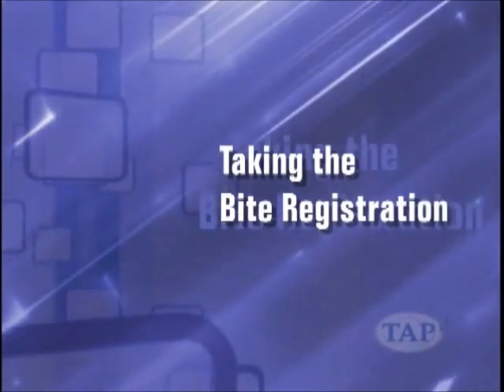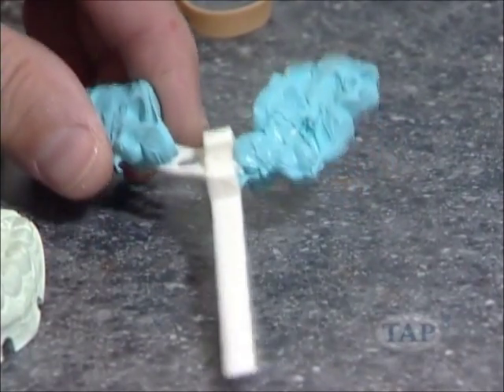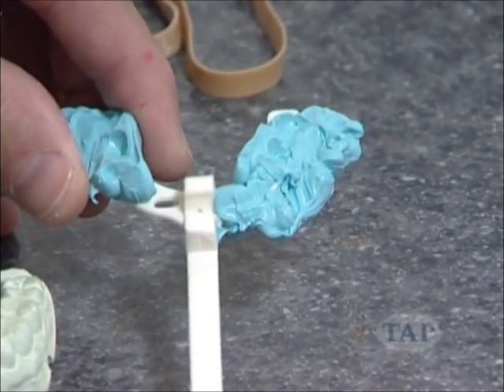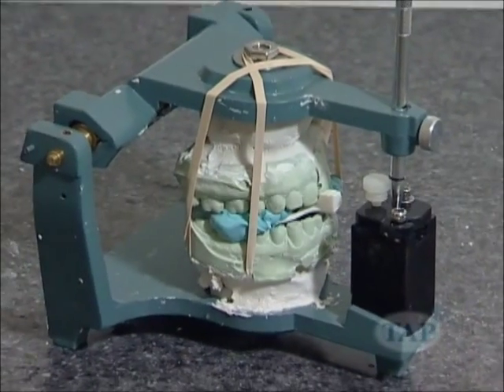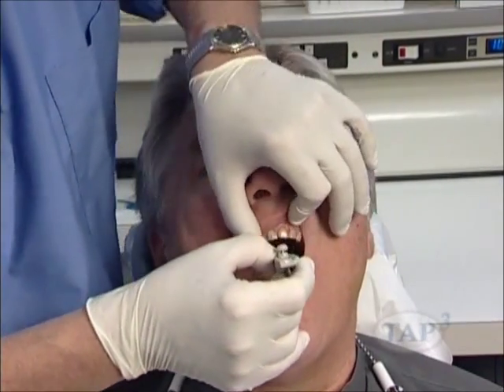Taking the bite registration. Before a TAP can be prescribed for a patient, the dentist must take a bite registration to send to the laboratory with a patient's stone models. Fit the George gauge in the patient's mouth with the handle at the midline.